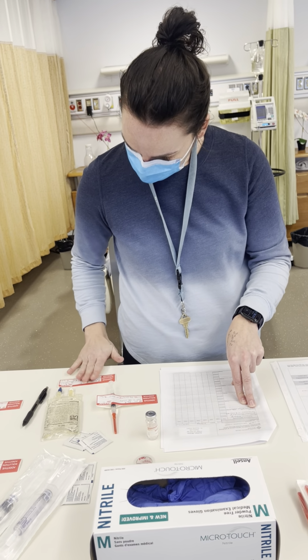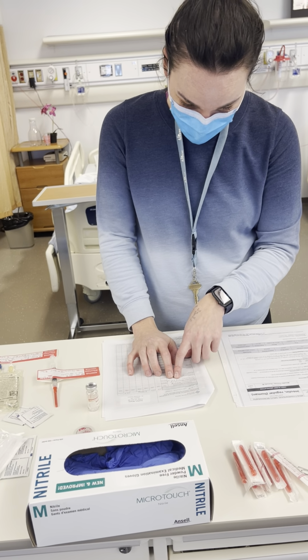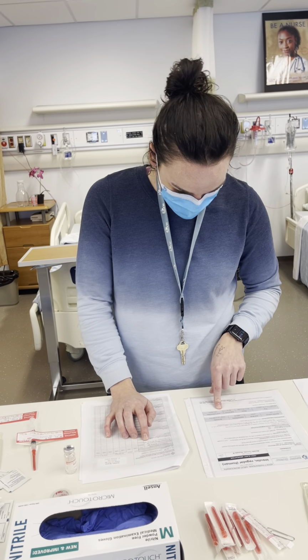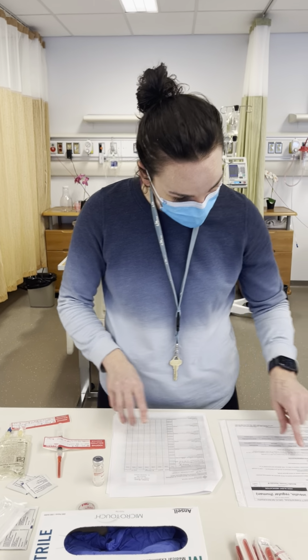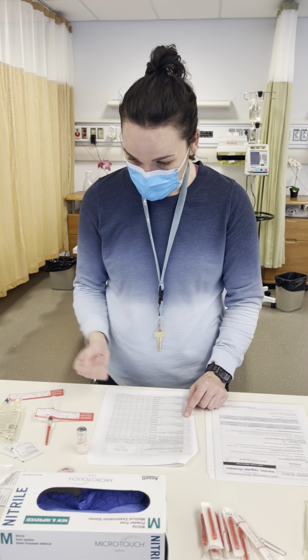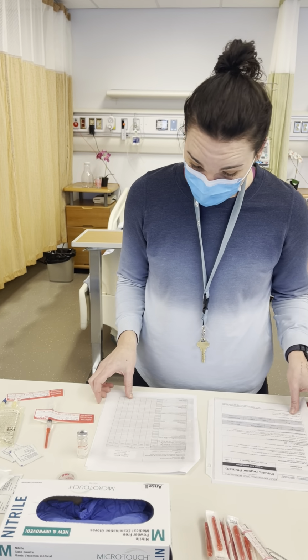Humulin R, and our label says Humulin R. Our dose is going to be 2 units per hour. So 2 units per hour. And we've got 2 units per hour on here, and that is within the safe range on our PDM, so that's good. Route is going to be IV continuous, and the time is going to be right now.